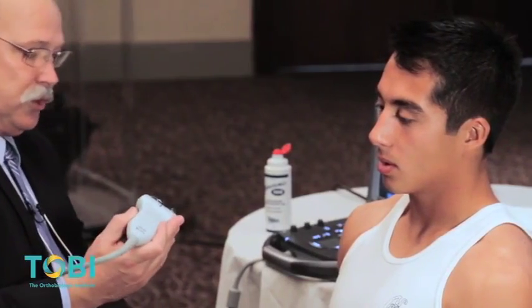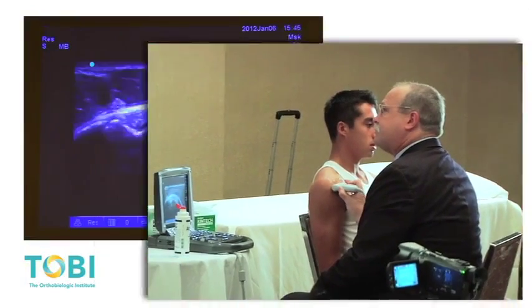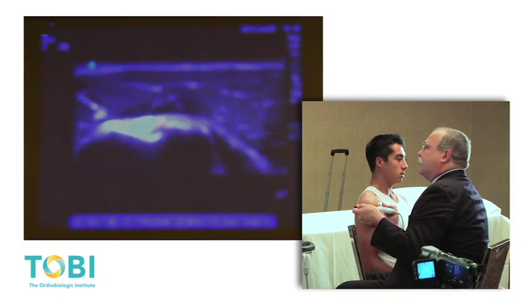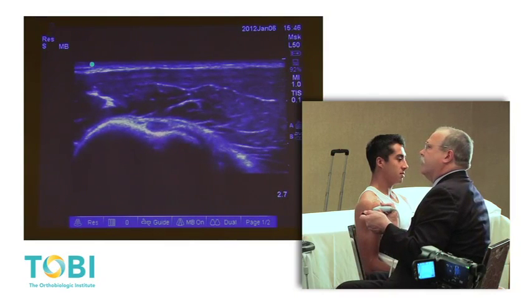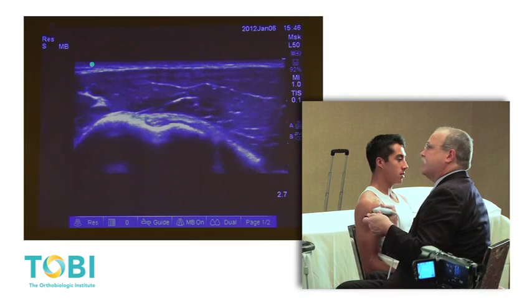Always start with the patient in neutral position, so I'm going to ask Kyle to just place his hand on his lap there. Transducer anteriorly on the shoulder, and go find the intertubercular groove. So you have the intertubercular groove, the biceps tendon on end. Notice how with beam angled off perpendicular, the tendon becomes dark. Example of anisotropy. Simple cephalad tilt produces a brightly echoic biceps tendon.